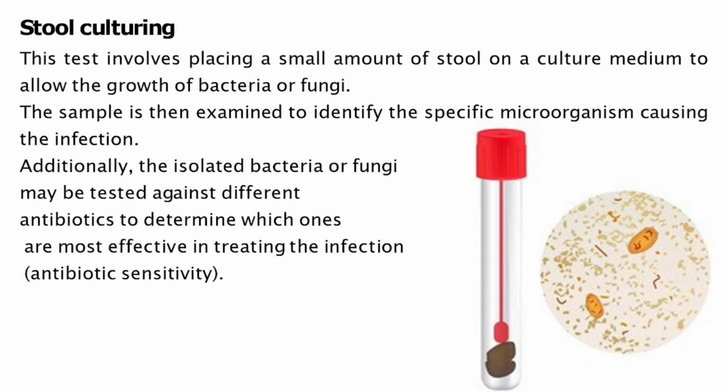This test involves placing a small amount of stool on a culture medium to allow the growth of bacteria or fungi. The sample is then examined to identify the specific microorganisms causing the infection.